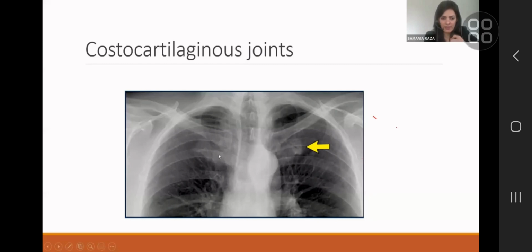It is easy to explain it or identify it as a normal appearance. But if you are reporting thousands of chest X-rays, there will still be one every now and then that you look at, and then you can't convince yourself that it is actually normal. And it is entirely reasonable to have a CT be recommended to clarify things.